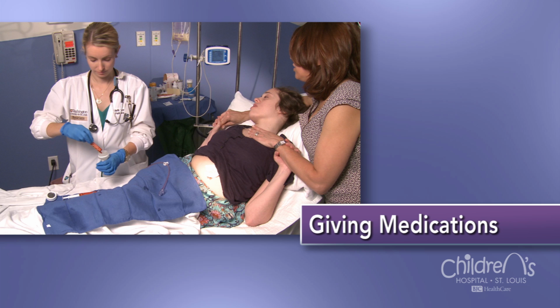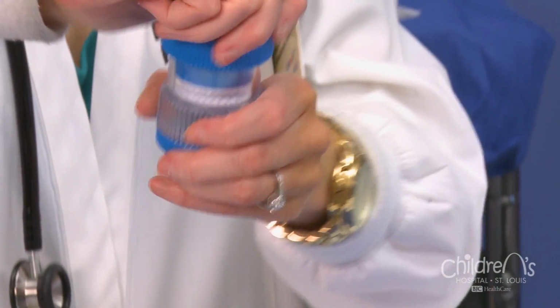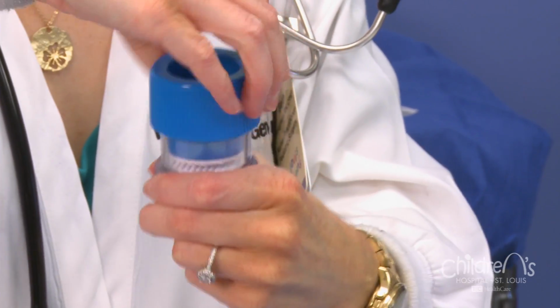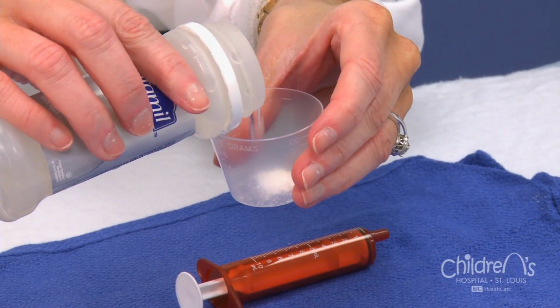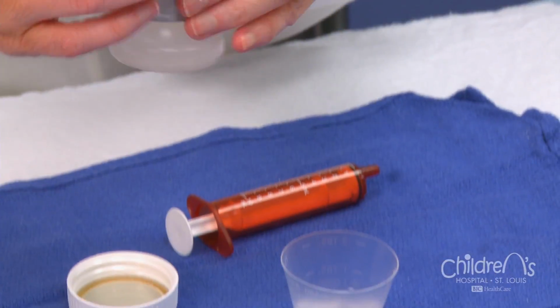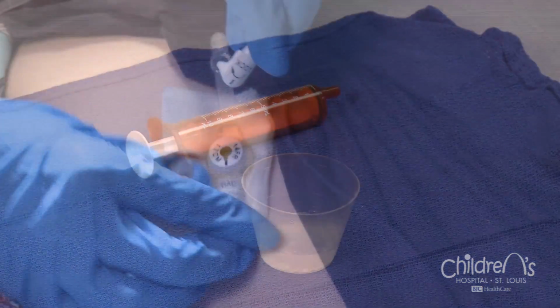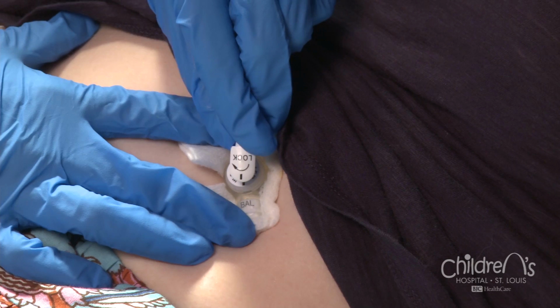When your child must receive medications through the button, ask your pharmacist to dispense all medications in liquid form if possible. Ask the pharmacist whether you can crush the tablets or open the capsules yourself if a liquid form is not available. Then dissolve them in water before delivering them through the gastrostomy appliance. To give medications through the button, follow these steps.